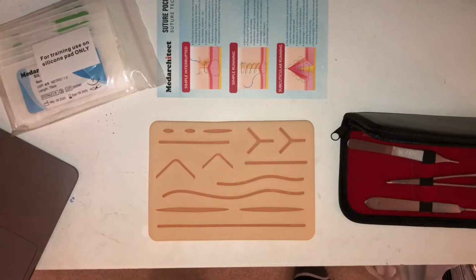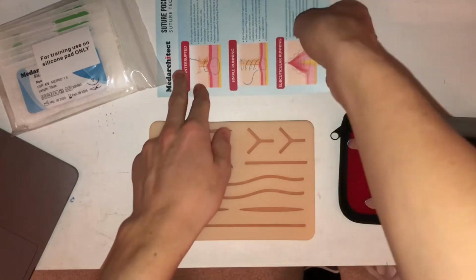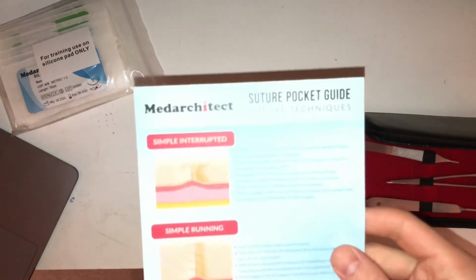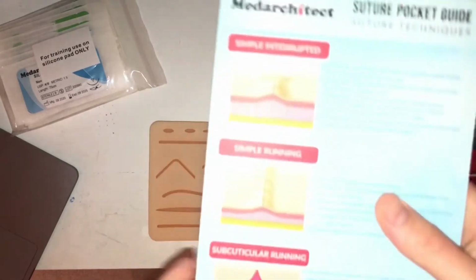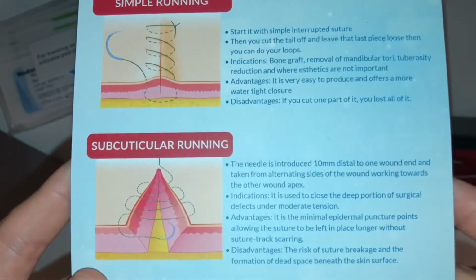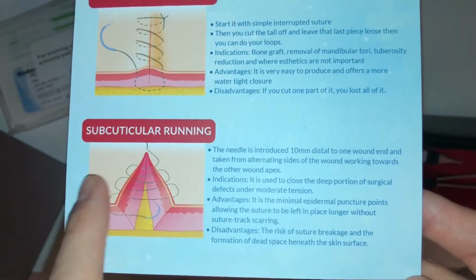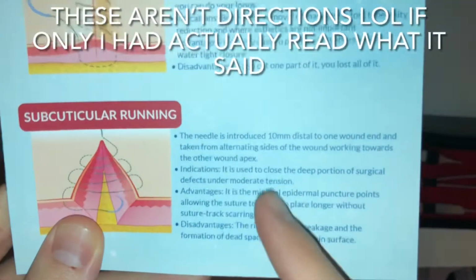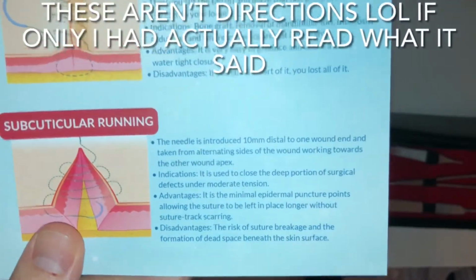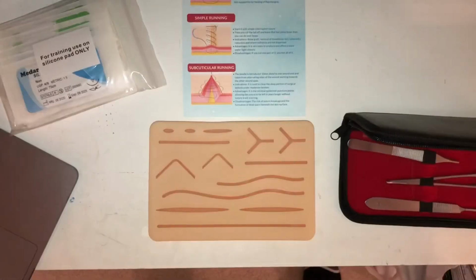Running subcuticular suture, level difficult, material: silicone skin and suture kit. Okay, so this is my silicone skin, this is my suture kit. If we look at the little packet we got, a subcuticular suture would be running, I think that's the only option. We can see what it's supposed to look like, kind of this zigzag pattern back and forth, and then you end with a little bit. We'll see if these directions are the same or different or close enough. But now we know that's the one we're going to be looking at. So let's get to it.